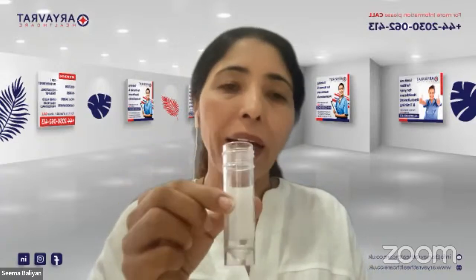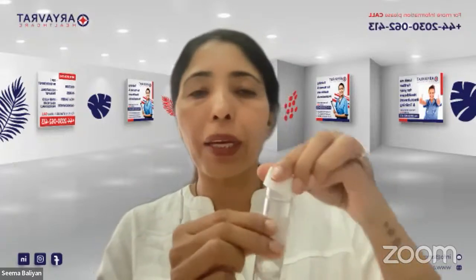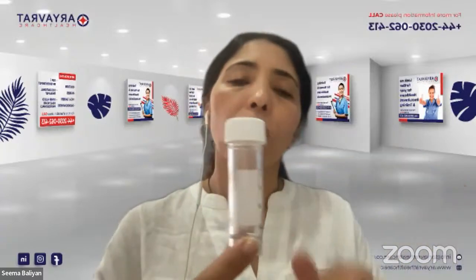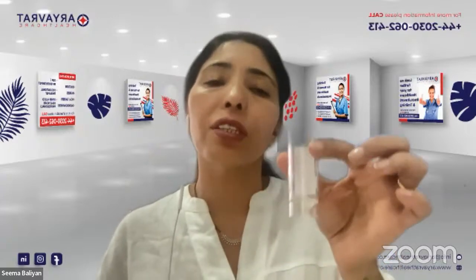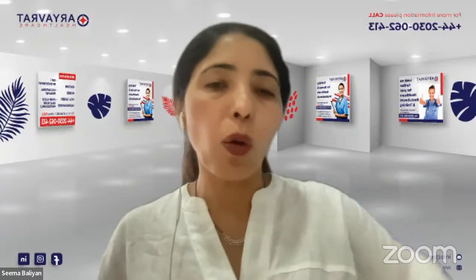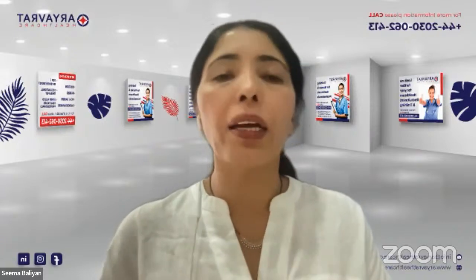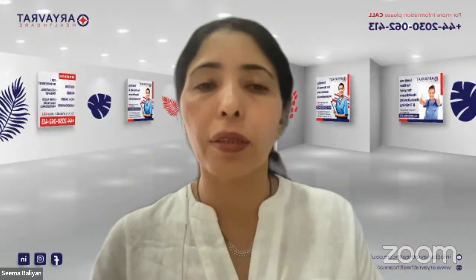Once they have done that, they can pass the rest of the urine into the toilet, again making sure we are not touching the rim. We close the container, and this is now a midstream urine specimen which is ready to be checked. You will tell all of these steps to the patient and ask them to come back once they have collected the urine, and in the meantime I will go and collect my articles.